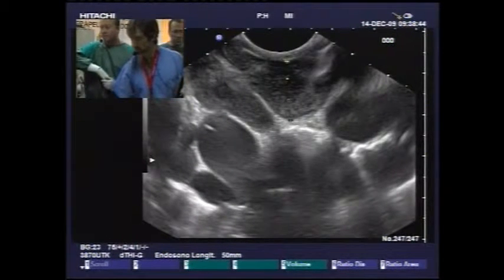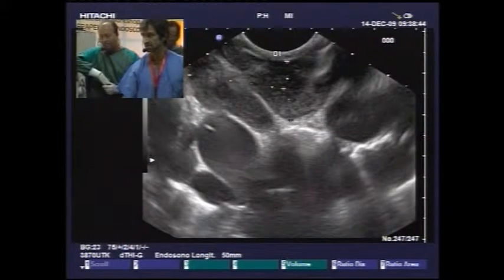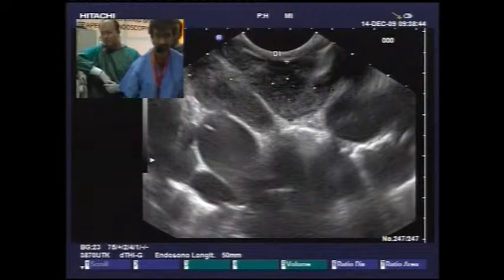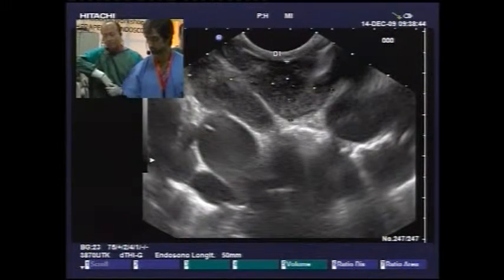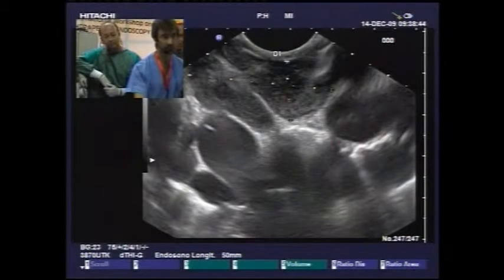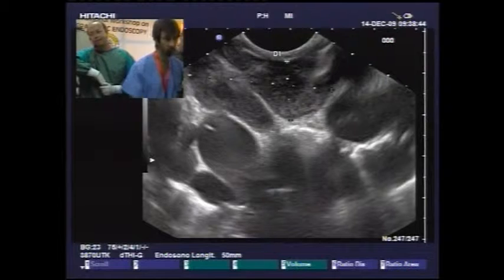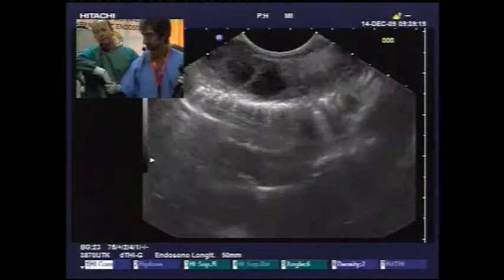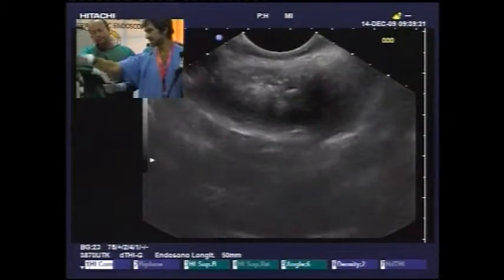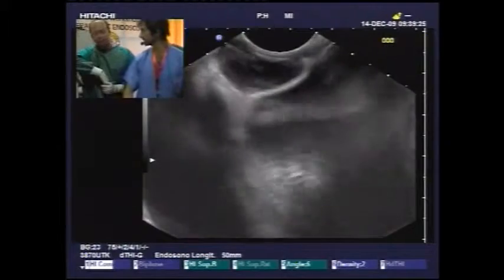Would you put antibiotics in the... Yeah, we generally add an antibiotic in the drainage fluid, but I'm not sure how that's going to help. Naji, have you sent some of the fluid off for microbiology? We will take it from the nasocystic tube because that's easier then. We'll send it for microbiology, cytology, get the CA levels done, everything. Although I'm fairly sure now from the way the fluid looks that it's only inflammatory fluid. But we'll send for everything.